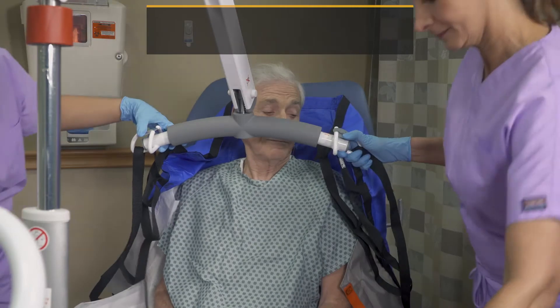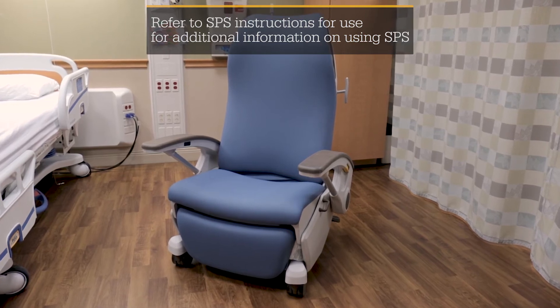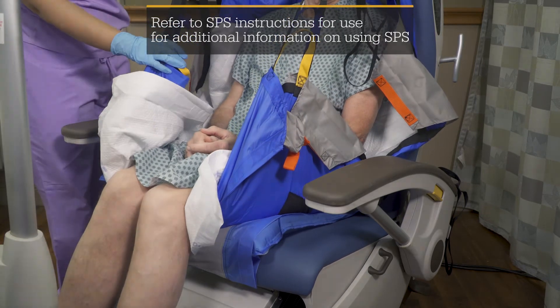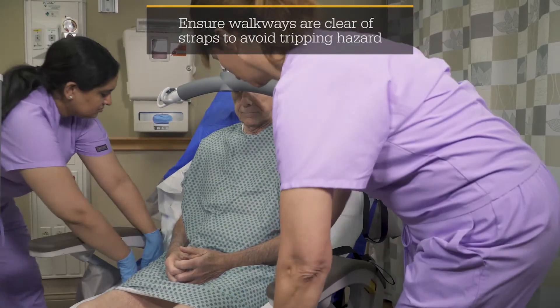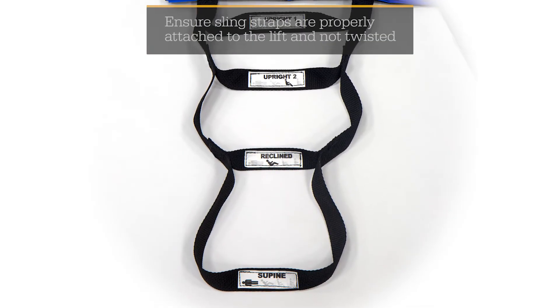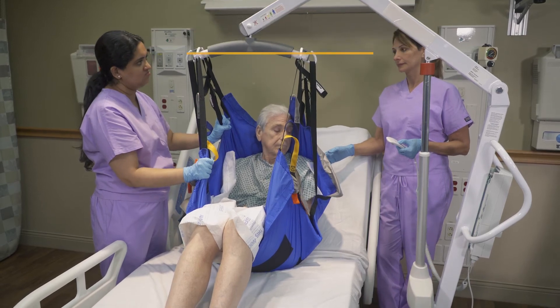Remove the sling straps from the lift. If you are transferring to a chair that has the Prevalon Seated Positioning System, or SPS, ensure that SPS stays in position during the transfer and that the patient is properly positioned on SPS and the chair. Tuck the sling straps out of the patient's reach. When transferring patients using the upright two or reclined options, make sure that the appropriate top straps are used. Follow the same process for lift transfers as demonstrated in the upright one position.